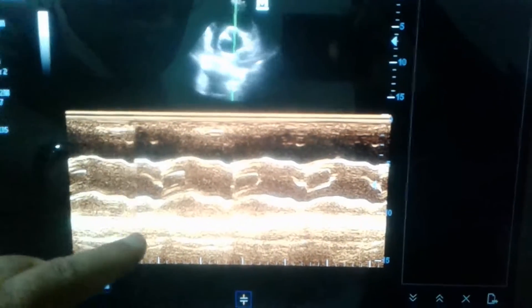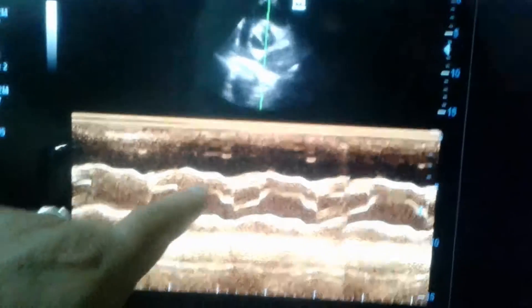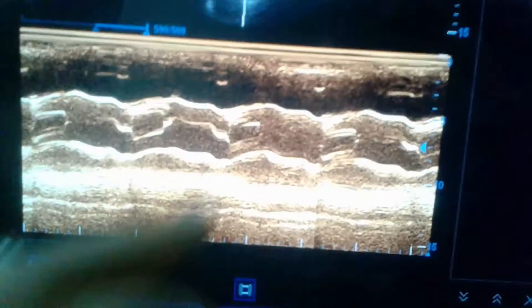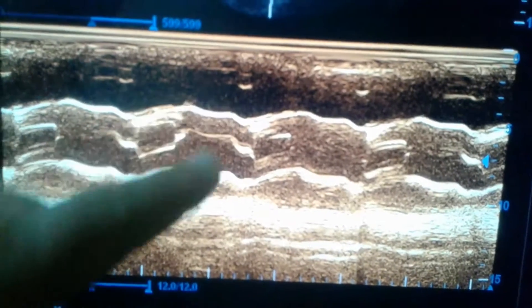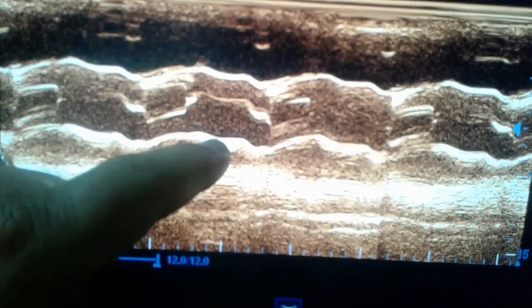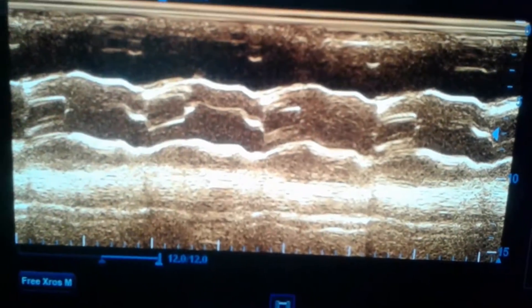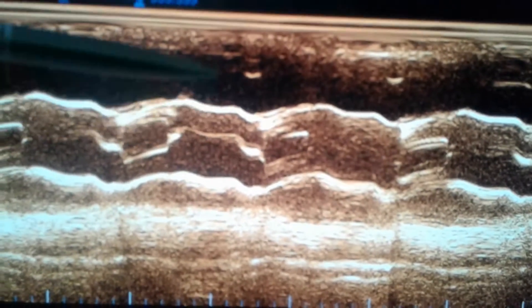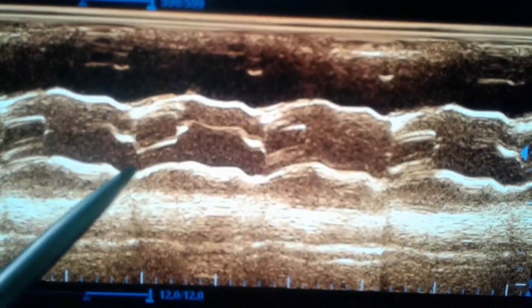Middle-aged male patient discovered accidentally with eccentric closure. Look here — the closure of the aortic valve is toward the upper line and far from the lower line. The aortic closure is toward the upper line and away from the lower line, eccentric. And this is the systolic ejection here in the box shape.